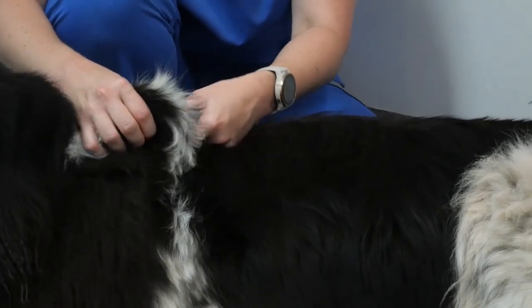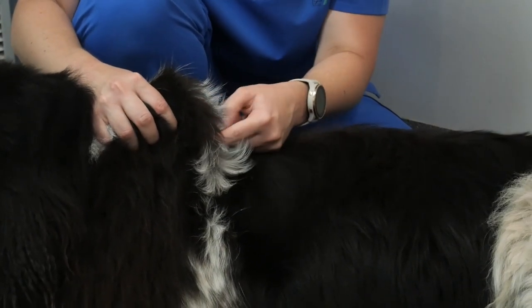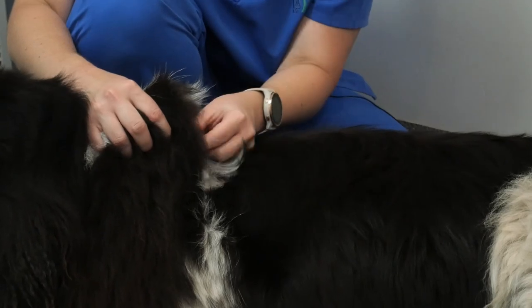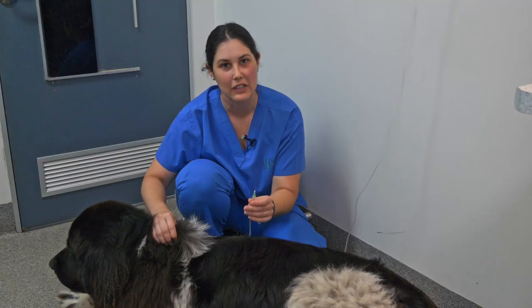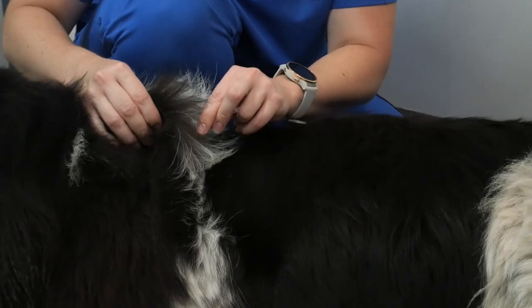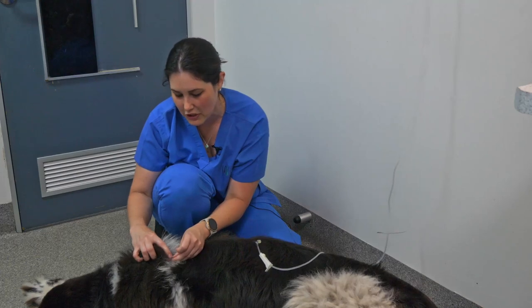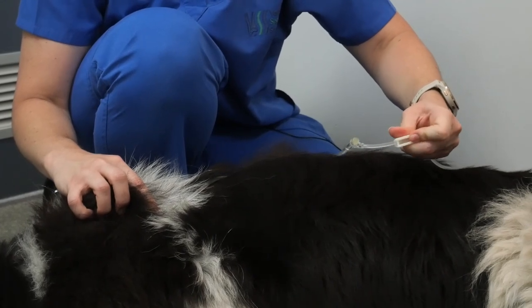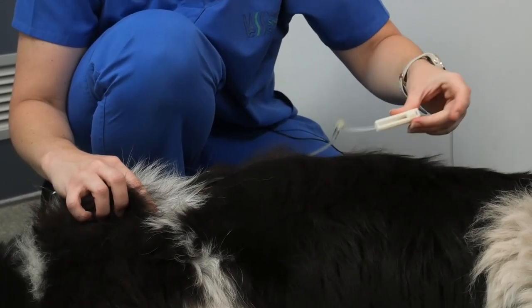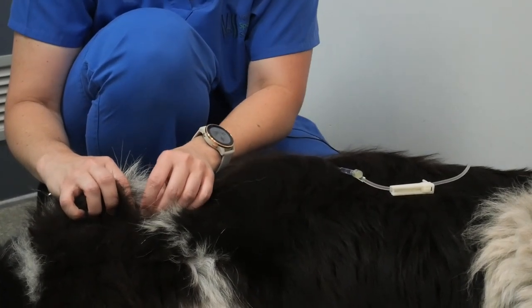Today I'm going to show you up here near the scruff of the neck. We've got a nice large tent here, just going in at the bottom of this V between my fingers. We want to keep our needle nice and clean — find the middle of our V and go straight under and in. To start our fluids, we position and hold the needle securely in place, then with our other hand roll that ball back to the top so the fluids are running from the bag by gravity down into our pet.